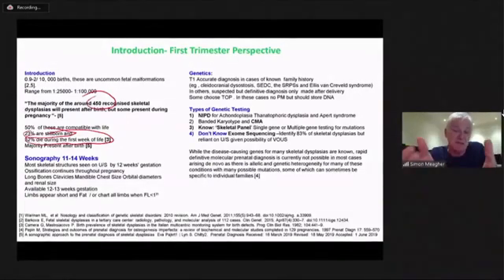And many of these are aneuploid. So aneuploidy is of no great significance in the second and third trimester onwards, but in the first trimester, it does play a role. So in terms of diagnosis of short limbs, it's usually in combination with multiple anomalies, and therefore it doesn't get the spotlight of being a skeletal dysplasia. It gets the spotlight of being an omphalocele or a facial cleft with short long bones.